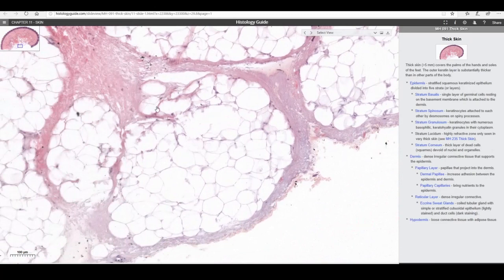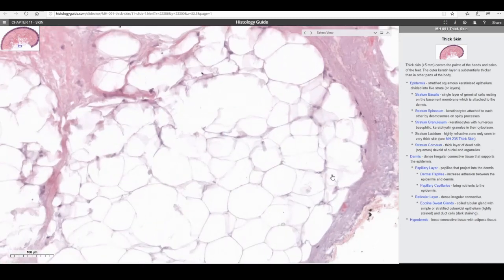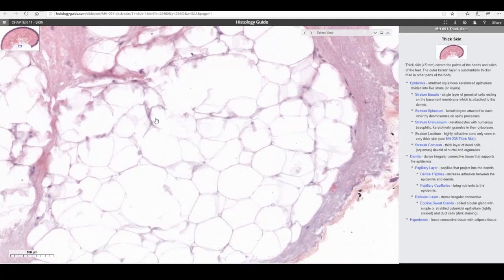There we go. So in this zoomed area, we can find these vacuoles, these empty spaces right here. And of course, these empty spaces were where the one big vacuole of lipid was present before the preparation of the slide, tissue preparation, as we discussed already in a past video. And we can typically see the nuclei pushed out to the side, in the periphery. For example, we can see a nucleus of an adipocyte right here or right here.